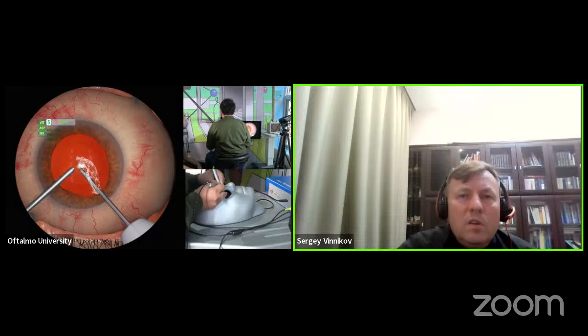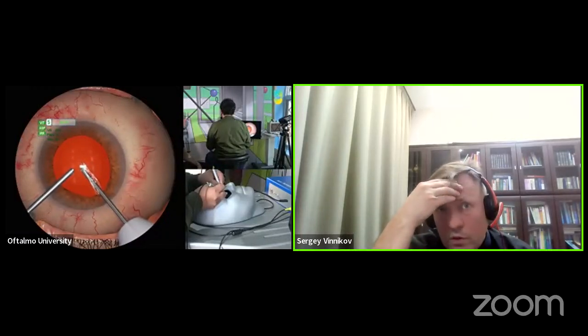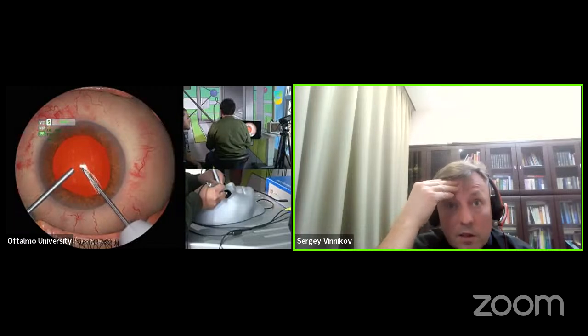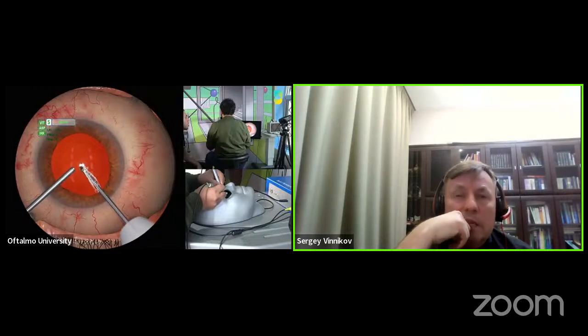Так, сейчас идет пересечение ножки, а когда ножка пересечена, можно спокойно удалять оставшееся стекловидное тело, поскольку оно уже никак не связано с задним отрезком и опасности такой не представляет.